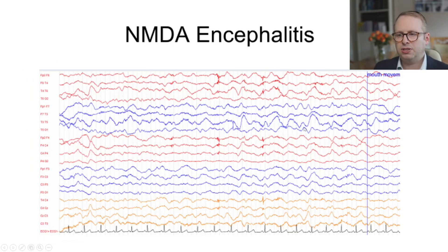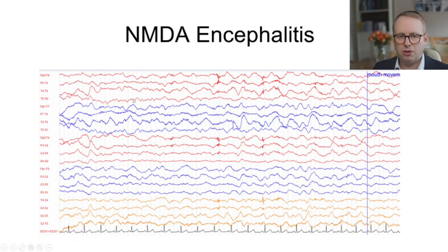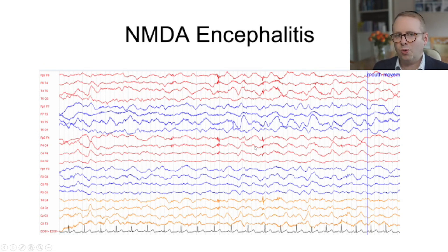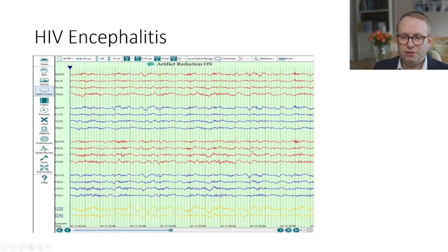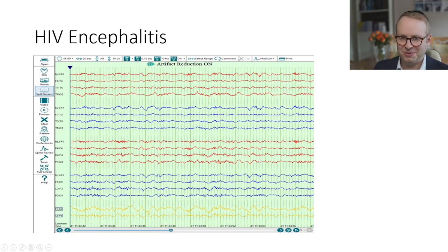This is someone who has NMDA encephalitis. What you can see here is slowing of brain activity and also lots of low voltage beta fast activity. Not all NMDA encephalitis cases have the extreme delta brush pattern — and this is why I've chosen this particular example. This is someone with HIV encephalitis where you can see an extreme delta brush pattern. So it's not 100% specific to NMDA and you can see it in a couple of other scenarios too.